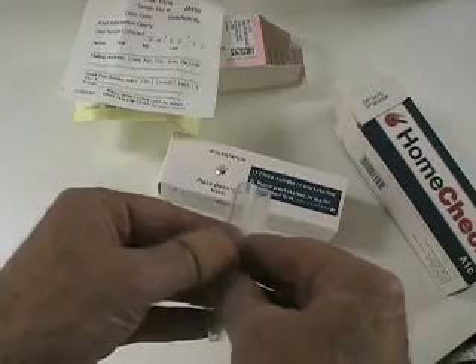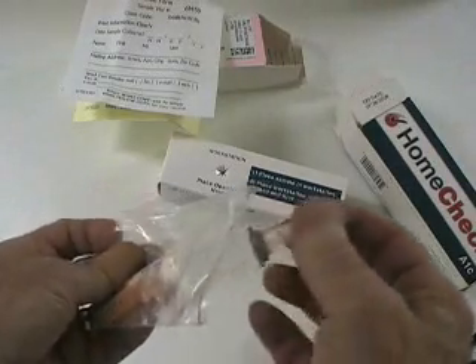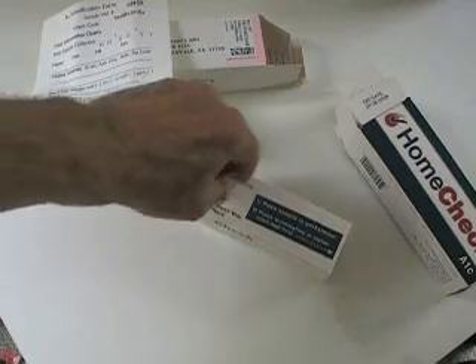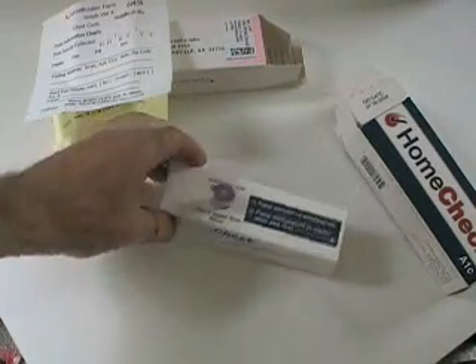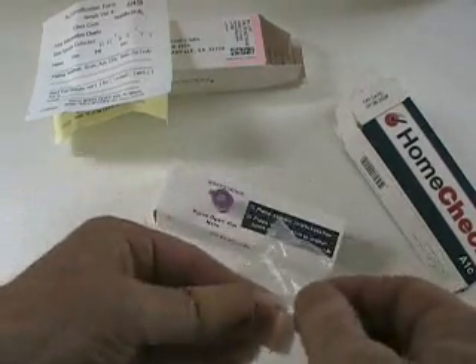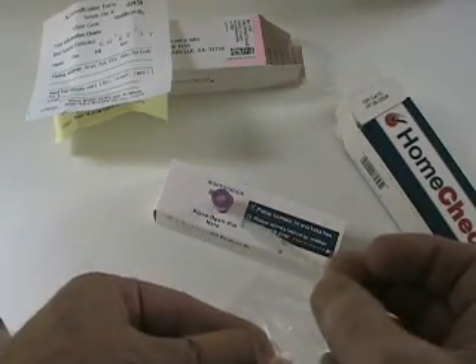Let's open the little Ziploc bag and see what's inside it. This is the little test tube — they call it a vial — that we're going to use to return the sample in. They want you to put the vial inside the workstation so it holds it. The other two things are this little capillary tube and a little squeezer.